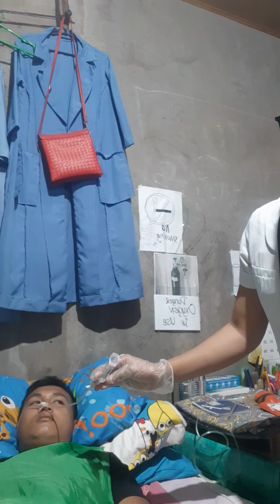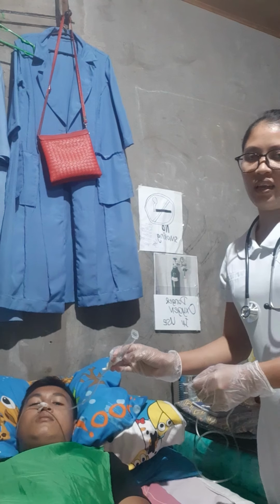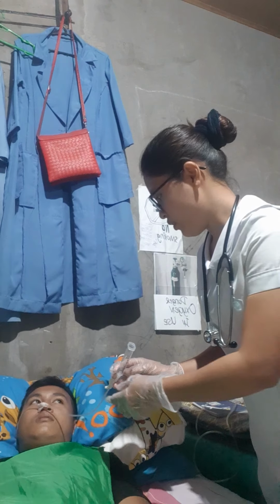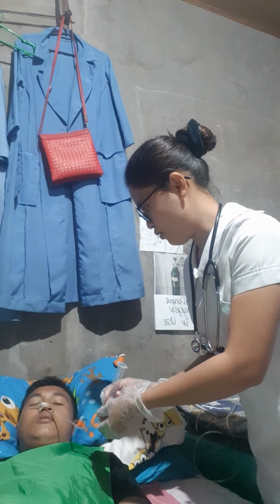Then pinch or clamp the tubing to stop the flow for a minute if the client is experiencing discomfort. So, sir, are you alright? Do you experience something bad? No. Okay.